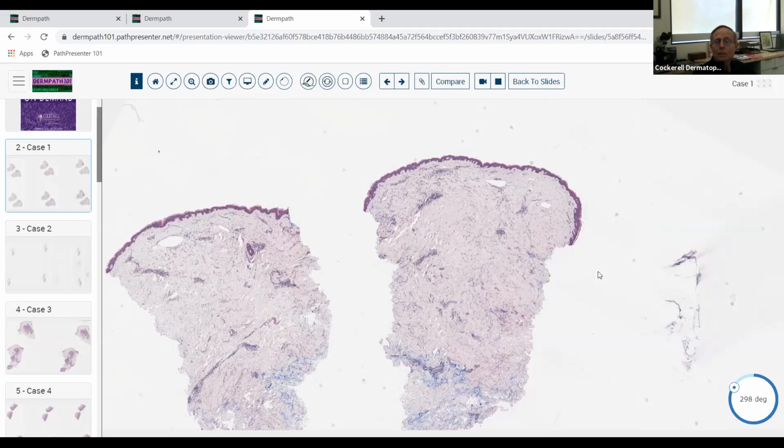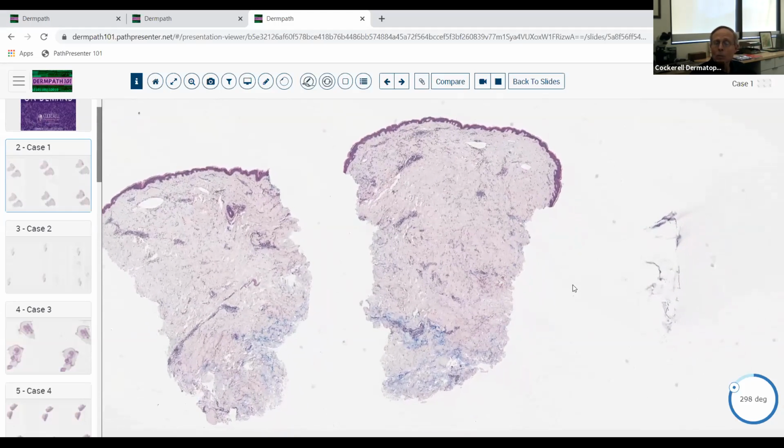And so what we'll do is we'll go through, I think, 15 cases today in about an hour, and then we may in the future cut that to 10, but we'll do this probably every couple of weeks. And we're going to incorporate these unknown sessions with some more didactic, straightforward talks that are more thematic, that we're in the process of finalizing. So for those of you who want to participate in an interactive way, you can go on the chat and post your thinking there if you'd like. Otherwise, you're welcome to just sit back and watch what we're doing here.